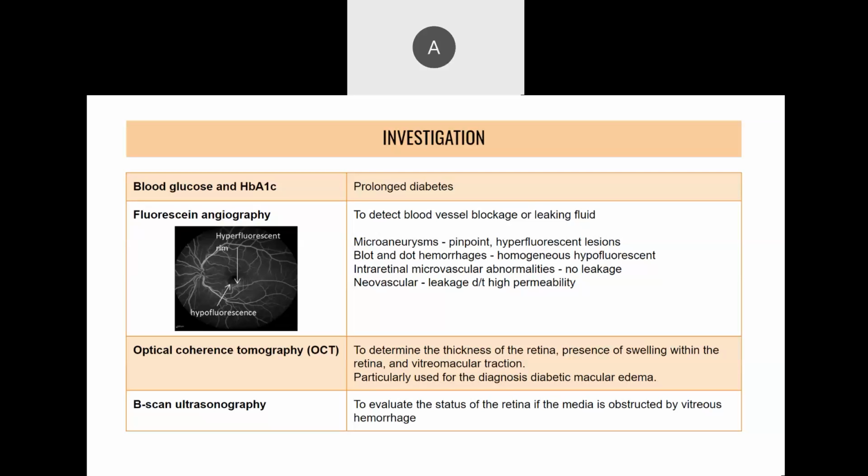So this is where the OCT helps in the diagnosis and treatment of diabetic macular edema. Okay, FFA we don't do much, unless the patient does not get better with treatment. If we see a patient with diabetic maculopathy, we give treatment, and they don't improve, only then we do FFA, but it's rarely done. And then B-scan, good.